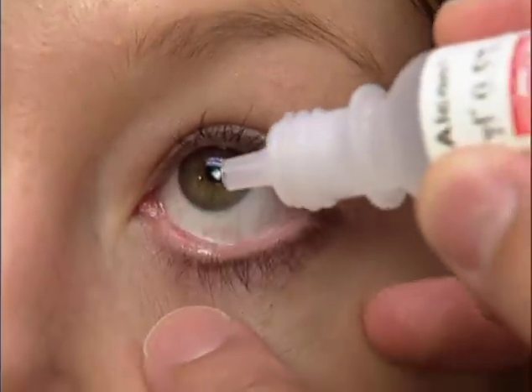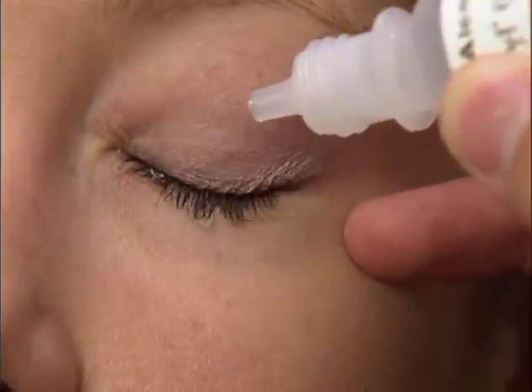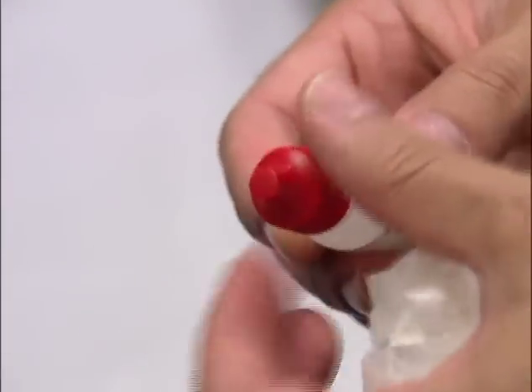The tip of the bottle should never come in contact with the patient's eye, eyelids, or lashes. If it does, the bottle is contaminated and could transmit infections. The bottle should be discarded. Dim the room lights to enhance pupillary dilation.